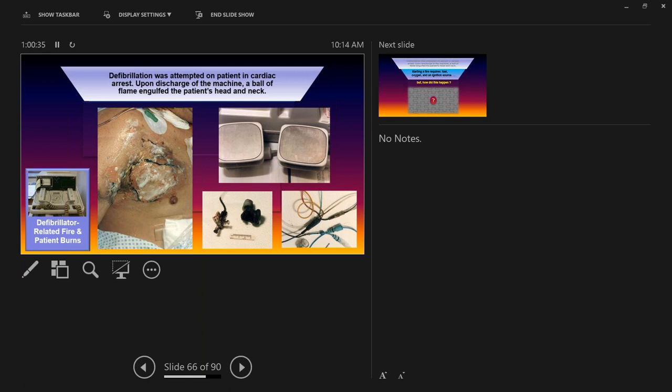I don't have to go down into the machine to do that. But that's a really good point. This kind of information is used, like with a defibrillator. You have to match up. If you had an event, all the equipment that's used on that patient, that time of day, should match up. Otherwise, it looks like there was a delay in bringing the defibrillator over. Something like that would be bad.